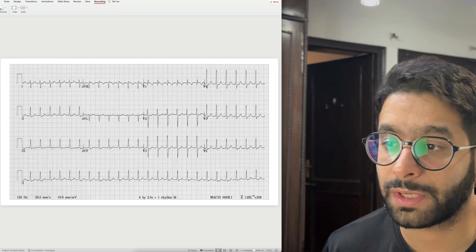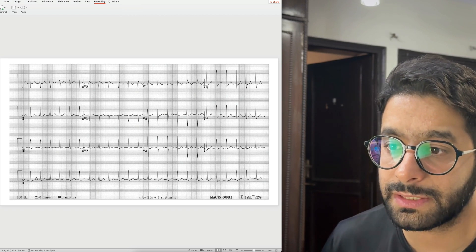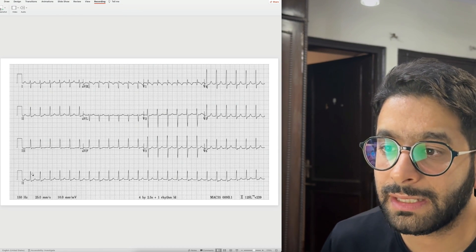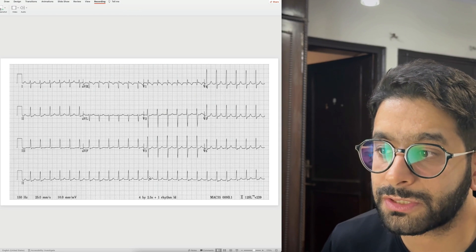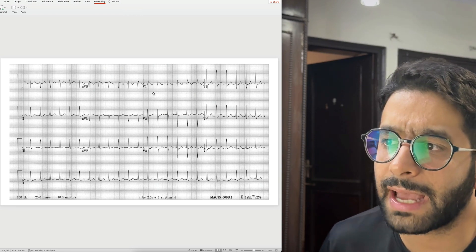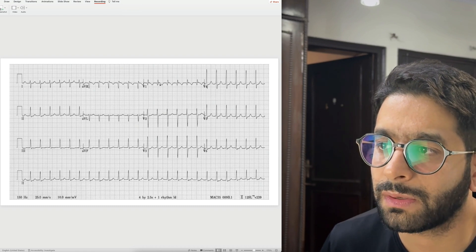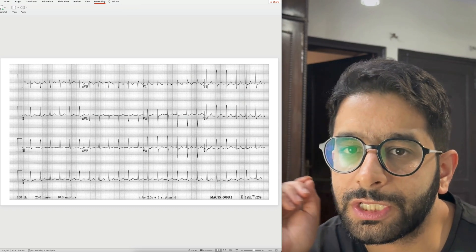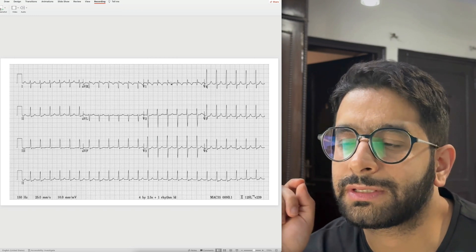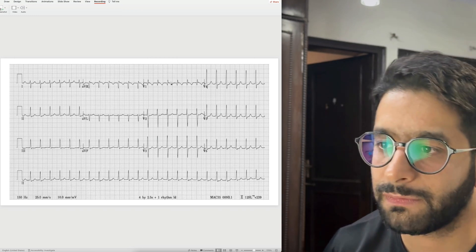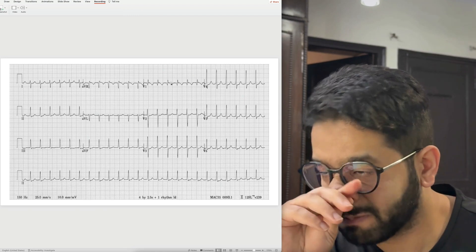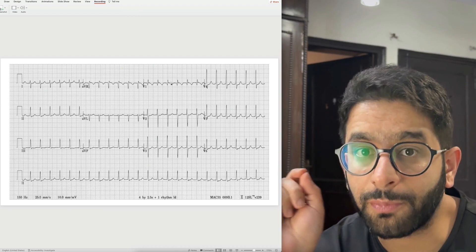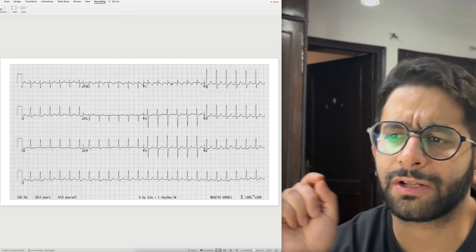This ECG shows tachycardia with a narrow QRS complex — it is regular, with roughly equal RR intervals. You cannot appreciate a clear P wave, but actually there is a P wave just after the QRS complex in lead V1. A regular, narrow complex tachycardia like this should make you think of SVT — supraventricular tachycardias like AVNRT or AVRT. Not a lethal problem, but patients do present to emergencies with palpitations, and prompt recognition leads to early diagnosis and treatment.